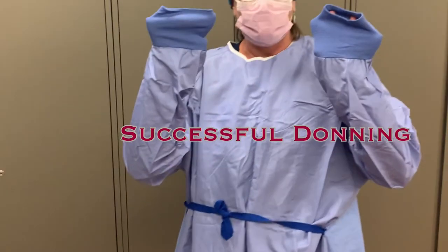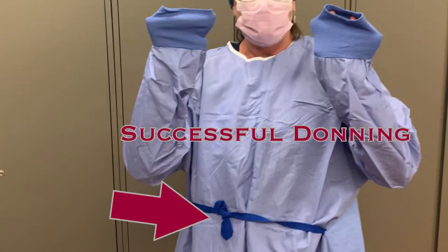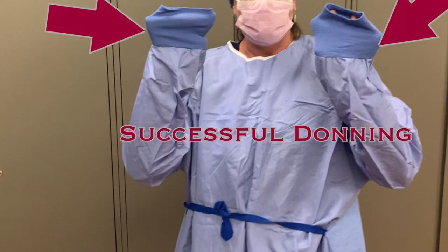If you have succeeded to this point, the gown should be tied behind your neck. Your arms are in the sleeves, but your hands are still contained within the gown. The gown is still tied in the front. Because your hands are inside the gown, you can grasp and manipulate your sterile gown and supplies with your hands as long as you are only grabbing with the sterile gown.